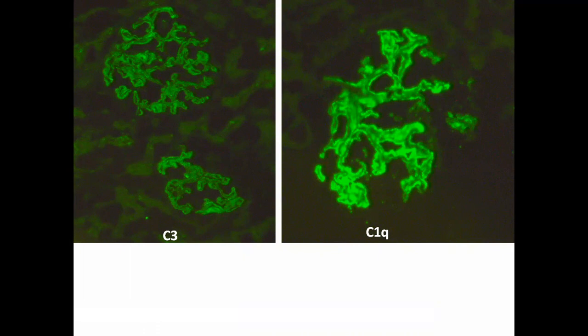I remember reporting, at that time I was not doing PLA2R or thrombospondin. I reported one case in a young female in which only IgG was there and C3 was very minimal. I reported that as membranous, and we didn't do PLA2R since there was no full house IF pattern and no C1q. I labeled that as possibly a primary membranous. This patient after 5 years comes with full blown SLE. So it is important that we remember that the full house immunofluorescence pattern will not be seen in all cases of membranous lupus.